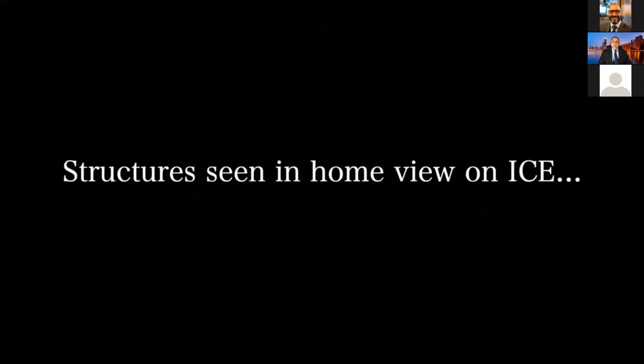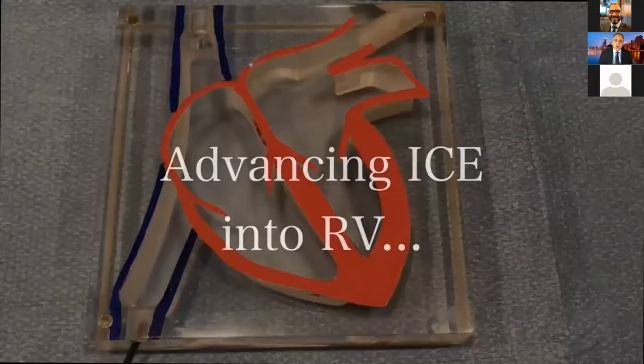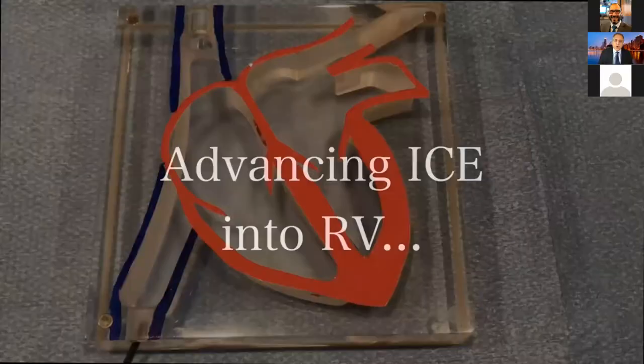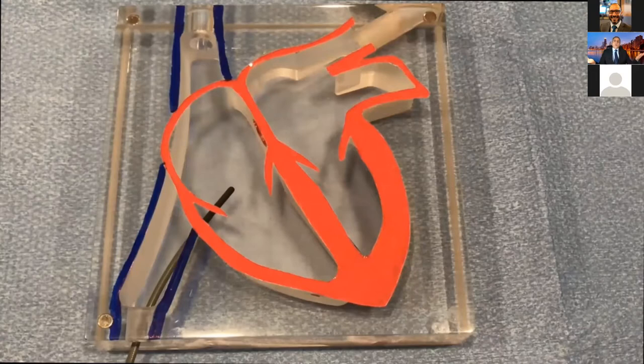What do we see in the home view? This is what we all know about. This is the CTI — we do the flutter line, this region, RV and RVOT, and you can see the inferior vena cava. First thing first — you always want to advance the ICE into the right ventricle to make sure there is no pericardial effusion that you've caused. This is a baseline pericardial effusion. How do you go to the right ventricle? You perform the anterior tilt.